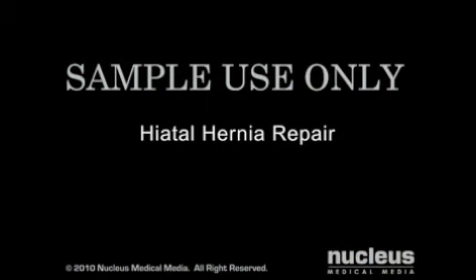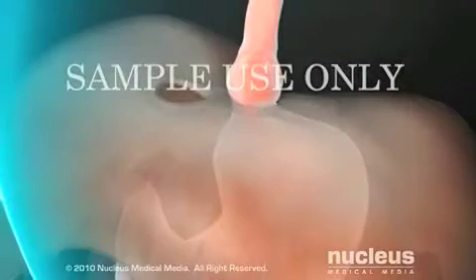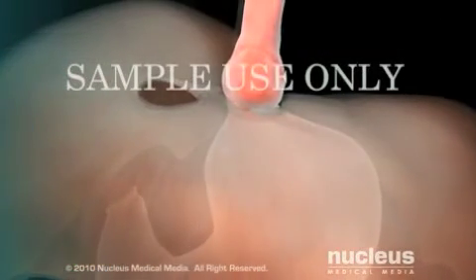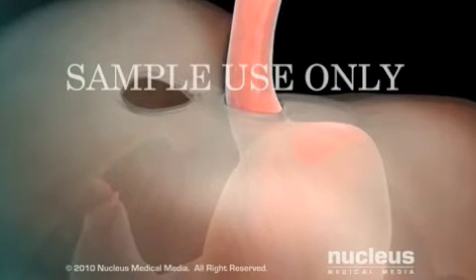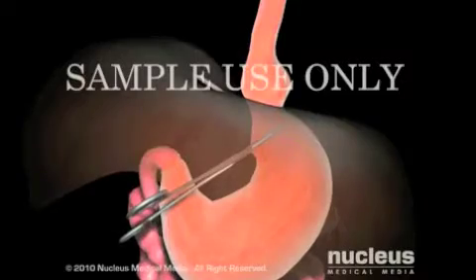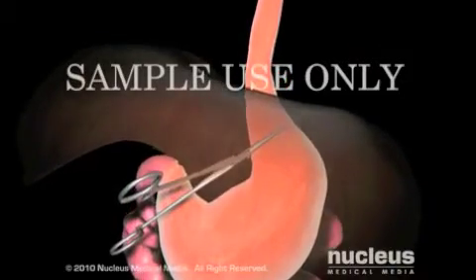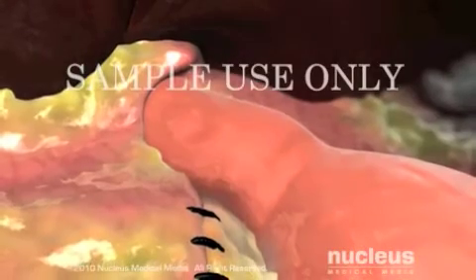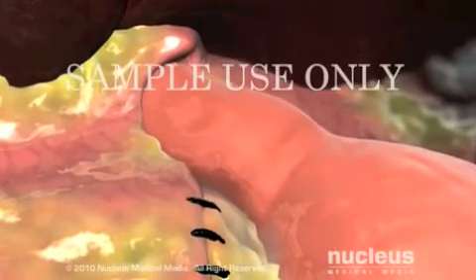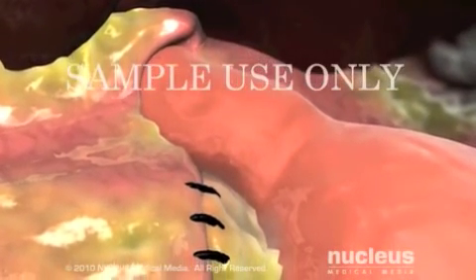If you have a hiatal hernia, your surgeon will pull the herniated part of the stomach back into place in the abdomen and tighten the hiatal ring in the diaphragm to prevent another hernia. This can be done through either an open or laparoscopic procedure. To complete the surgery, the abdominal incisions are closed with stitches or staples.